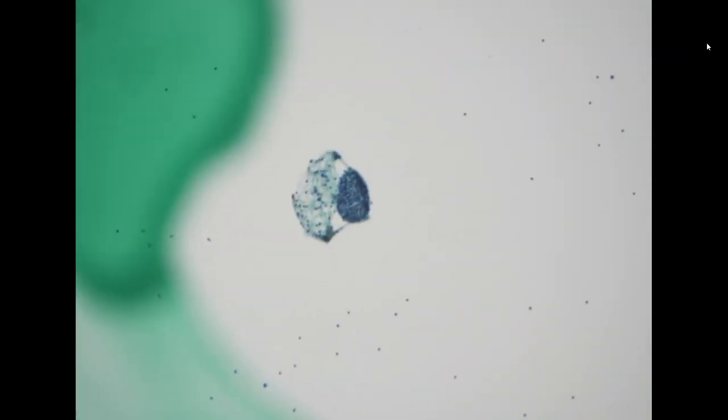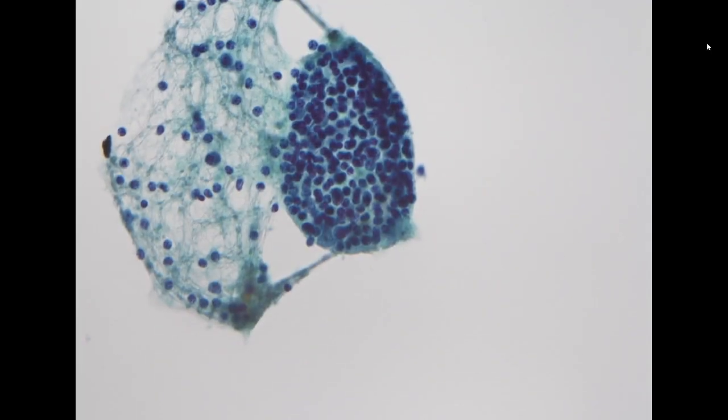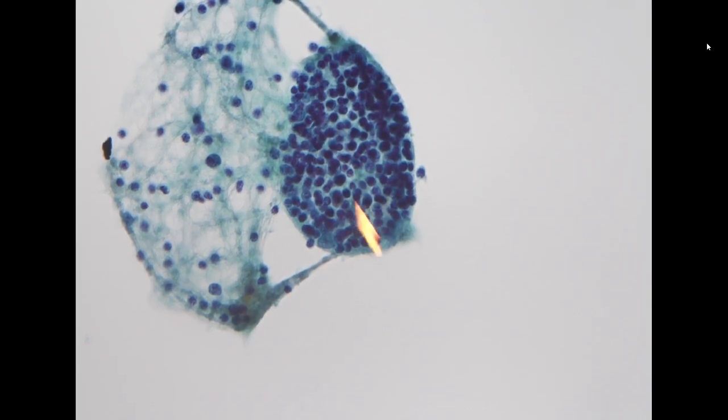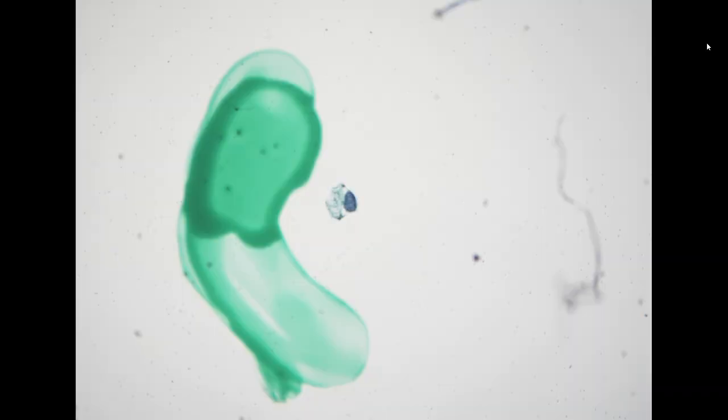So supposedly it's a cystic aspiration, a cystic specimen. And here we also see one cluster of very hyperchromatic but small size cells. These are lymphocytes, right? You can tell from the slightly clumped chromatin pattern and high N/C ratio. These are all lymphocytes, so we see lymphocytic stroma here. So we have lymphocytic stroma, we have cystic background, and that's it.